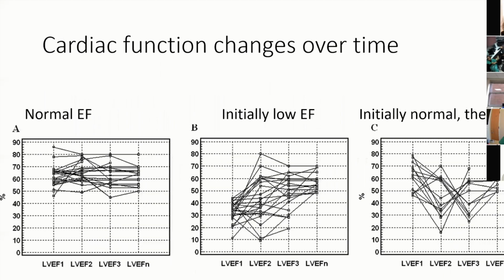And to just give you an idea about what happens over time, this is actually one of the first echo studies that was looking at septic patients, and it was done using transesophageal echo. In France at the time, this was considered kind of standard of care, and was done without consent. They just said, sure, we'll throw a TEE in all of our intubated septic patients. You can see here on the left, we have a group of patients with normal-ish ejection fraction who stayed that way for the first 3 days. And then they did a follow-up several days later.